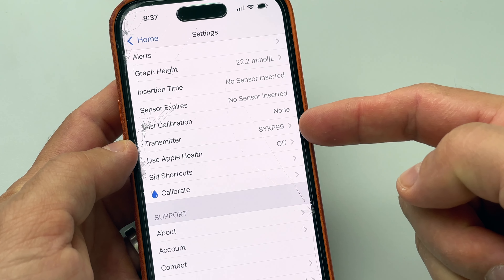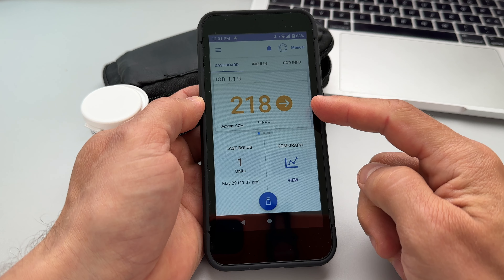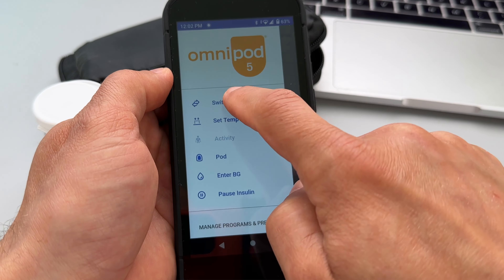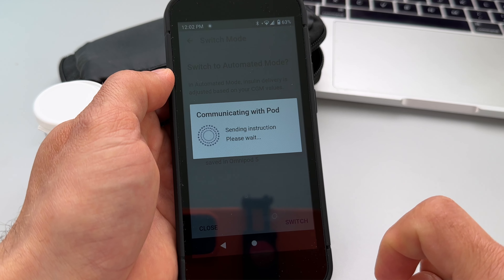I applied a new Dexcom G6 sensor and started it in the Dexcom G6 app. After applying my sensor I realized I made another mistake — I put the devices on opposite arms. When you place them like that they can sometimes lose connection and the pod stops receiving data from the sensor. It's much better to place them in one line of sight so there is not so much of your body between them — for example, Omnipod on one side and Dexcom on the same side.